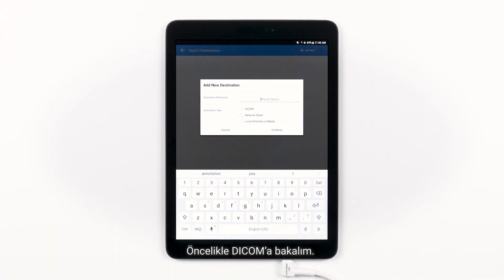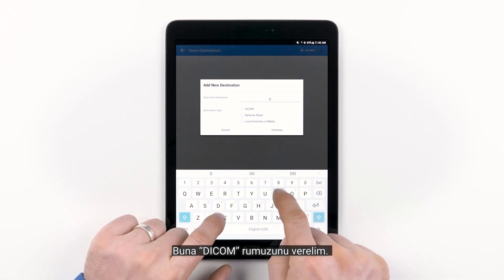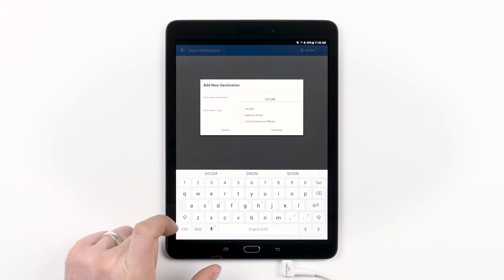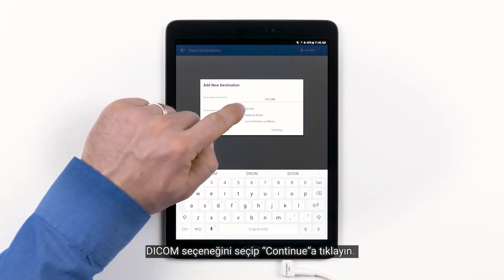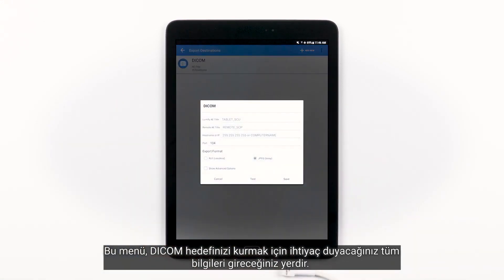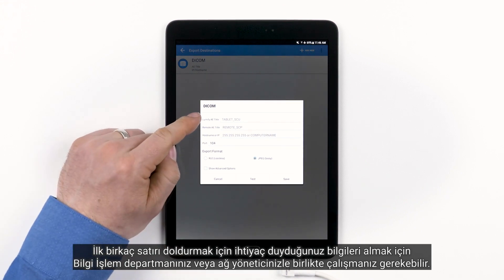First, let's look at DICOM. Let's give it the nickname DICOM. Select the DICOM option and then tap Continue. This menu is where you will plug in all of the information that you're going to need to set up your DICOM destination. You may need to work with your IT department or network admin to get the information you need to fill in the first few lines.